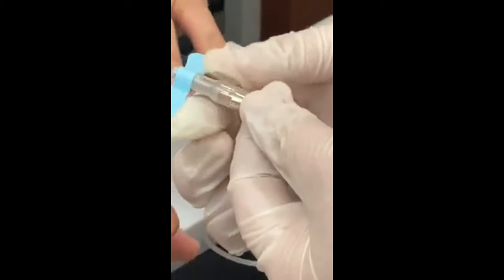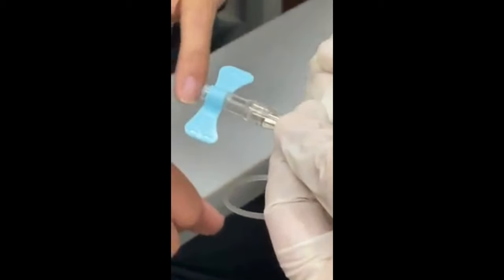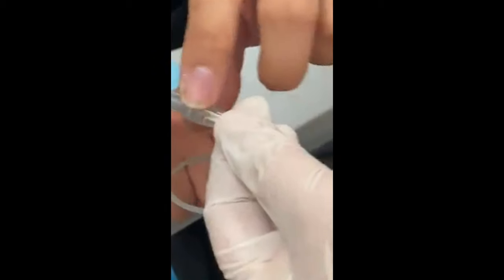Okay, so what I'm going to do is... Oh, no, since you already pressed the button, you don't need to catch it anymore, because you already pressed it. Okay, so I can just put it in the sharps container? Yeah, put it directly into the sharps container. Perfect.